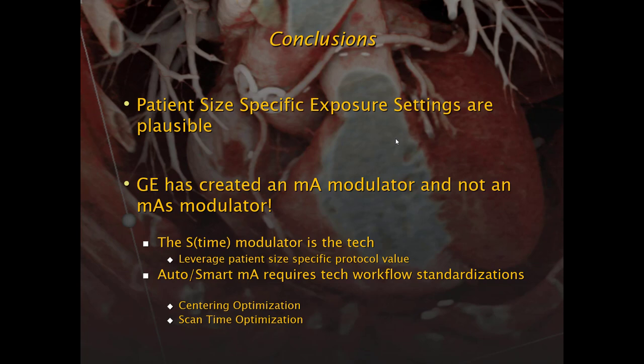AutoMA and SmartMA tools work very well, but they require some tech workflow standardizations, of which are centering optimizations and scan time optimizations. And with this, I thank you very much for your time.